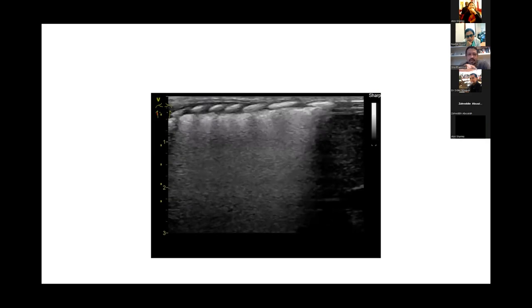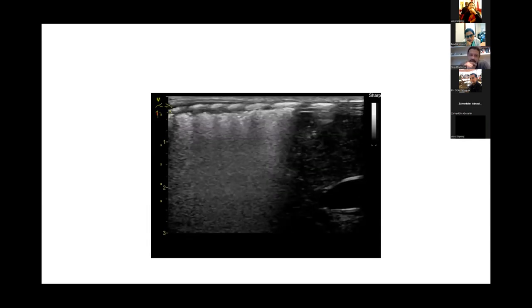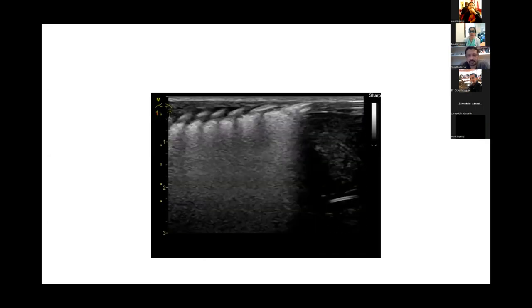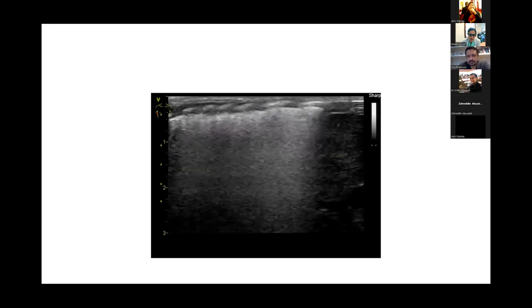Post-extubation complications, as some areas of collapse happened. And also the X-ray showed some RDS as well. So lack of aeration could be seen and appreciated in most of the videos. Yeah, this is a 24-weeker though, and that has really not been extubated. So that was something we would expect to see.